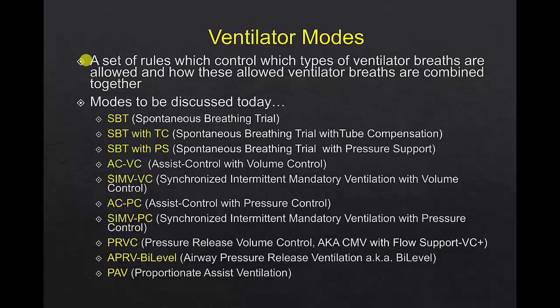Modes to be discussed today include spontaneous breathing trials with tube compensation and with pressure support, assist control with volume control, synchronized IMV with volume control, assist control with pressure control.